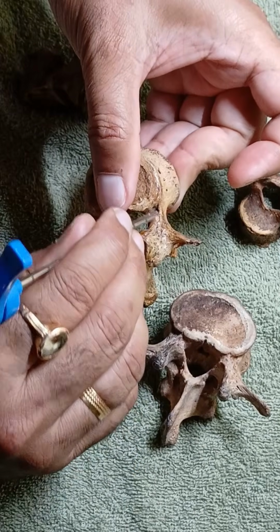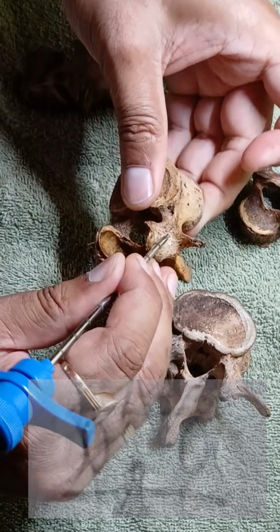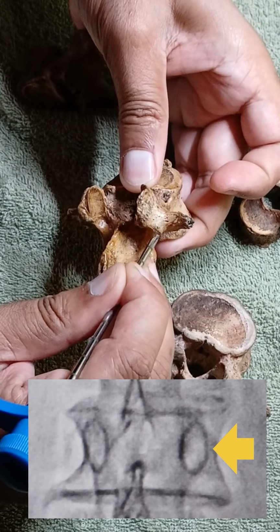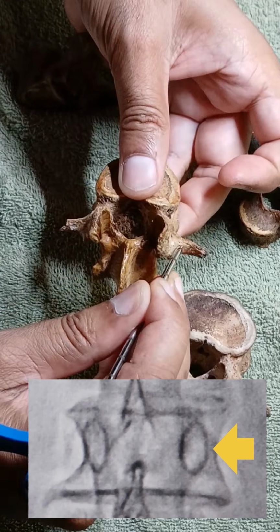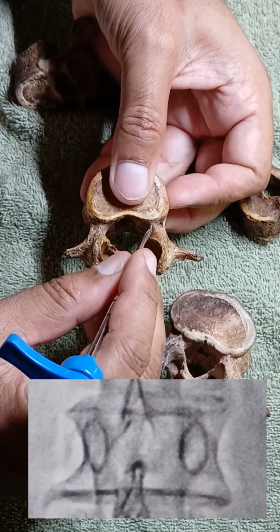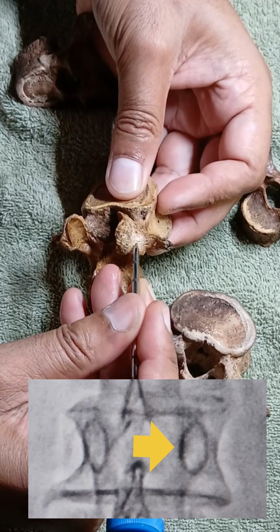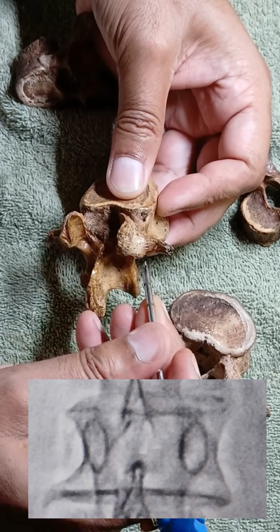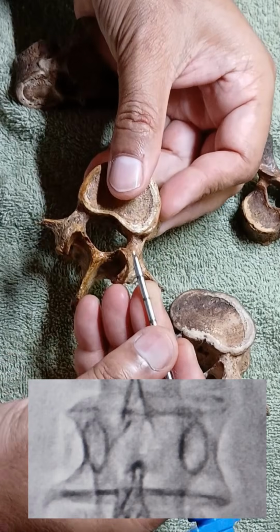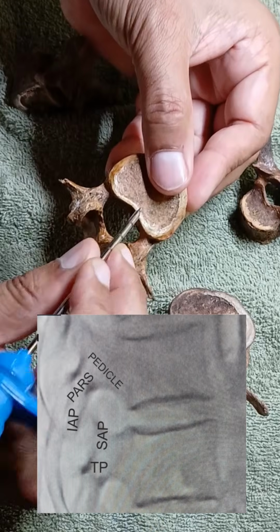If you see the lateral surface, that is making the lateral border of this circular pedicle silhouette. And you can see this is the medial border of the pedicle. I cannot cross the medial border of the pedicle until I am entering the posterior surface of the body.